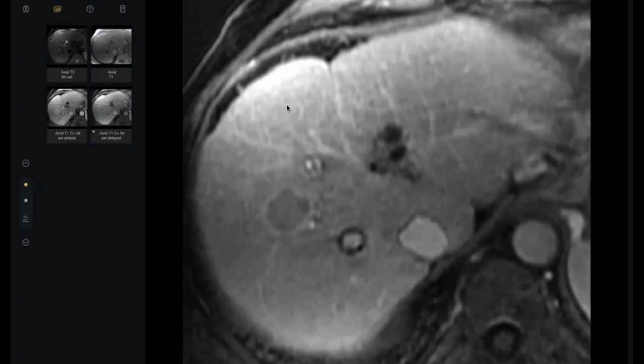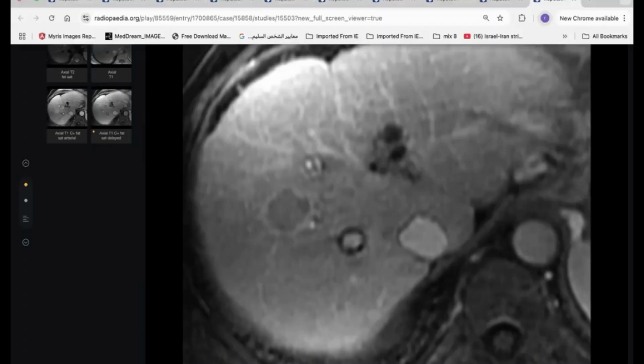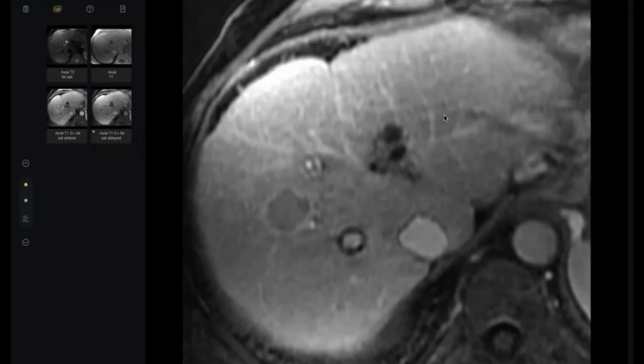now you are presented with an examination, especially CT or MRI, for this high-risk patient, you should apply the major features and the ancillary features of LI-RADS. This is just a general introduction. I will not talk about them today, but I will give you some keys to be sure whether this is malignant or not, or whether this is HCC or not. And I think this is important in our RCR exam. So let's start with our first candidate.